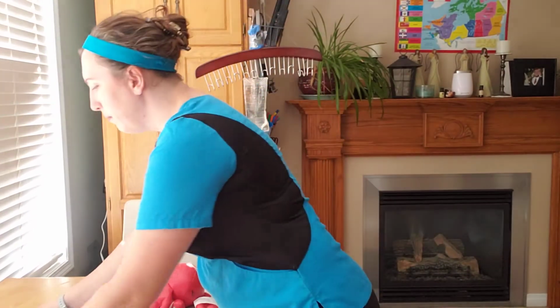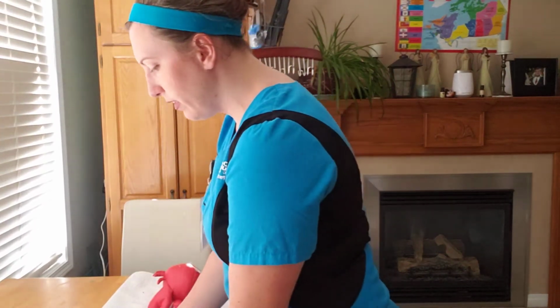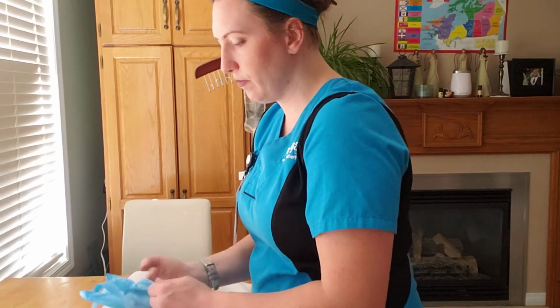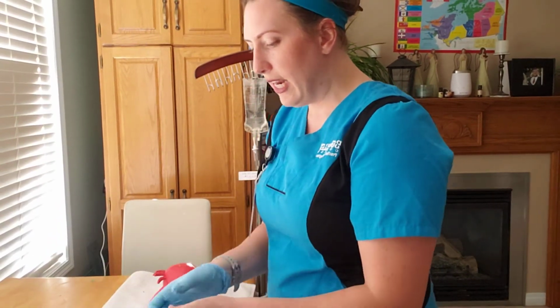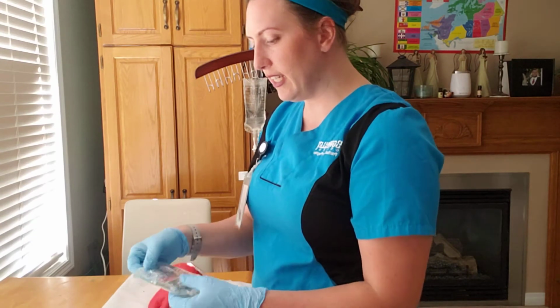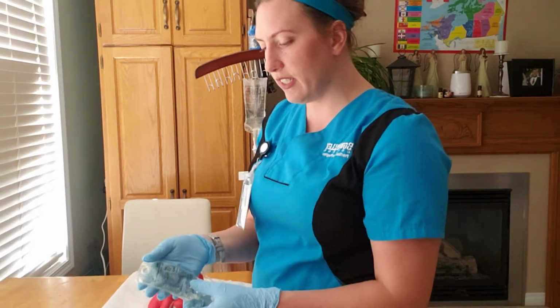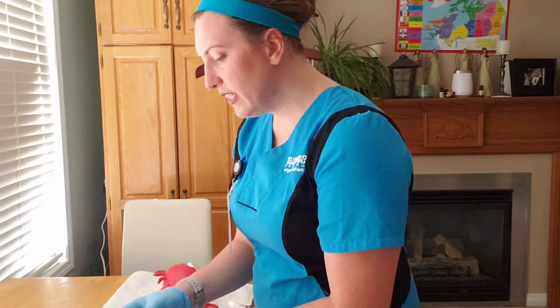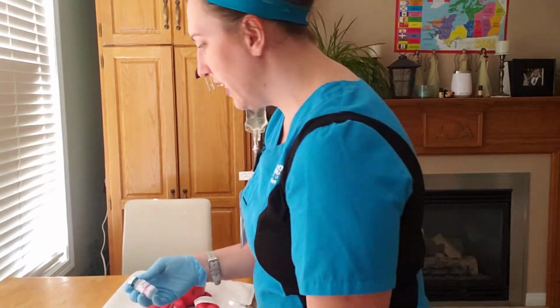I'm just going to set my MAR in my scenario above. My monograph is here. First thing I'm going to do is put some gloves on. And I'm going to pull my medication and my intravenous dilution, my fluid for intravenous infusion. Okay, so first thing is the medication. I'm going to check this to the MAR.